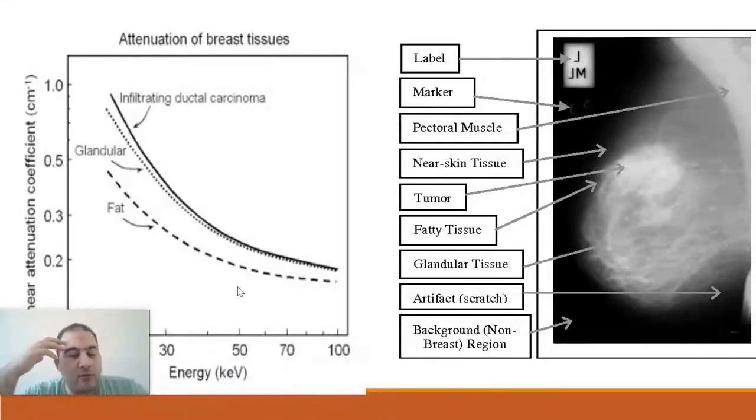In contrast, for example, when we were doing regular X-ray radiography, I was imaging the kidneys and bones, and there are significant and clear differences between the organs present. In the breast, you are talking about soft tissue. It has fat and soft tissue, all with low physical densities. If you want to differentiate between these different densities, you need to consider that the machine itself, as well as the positioning of the breast during imaging, must be done in a certain way.